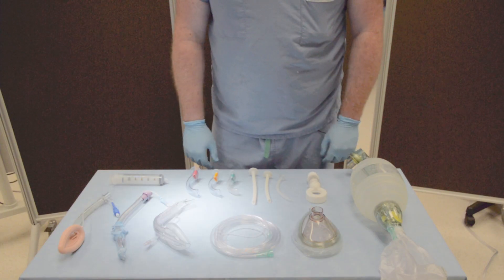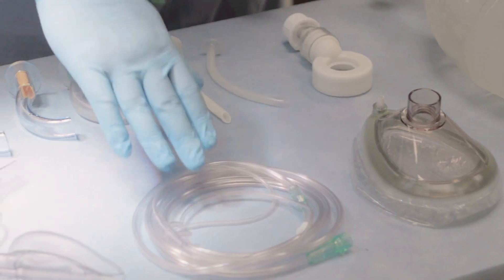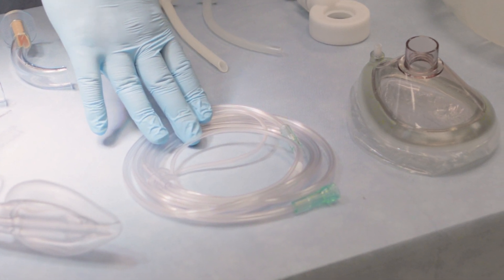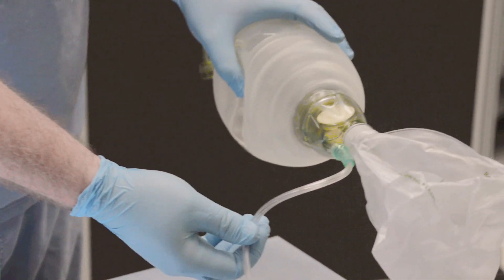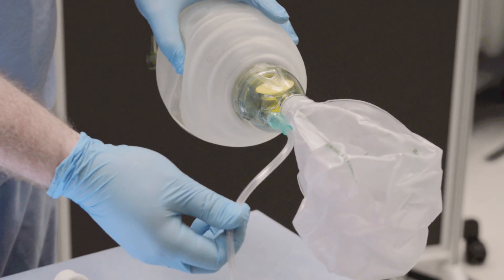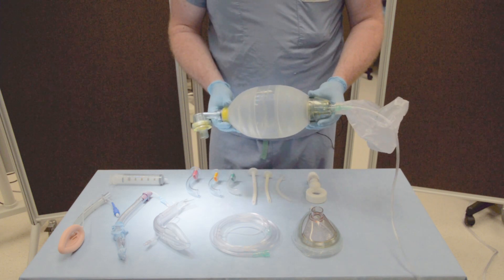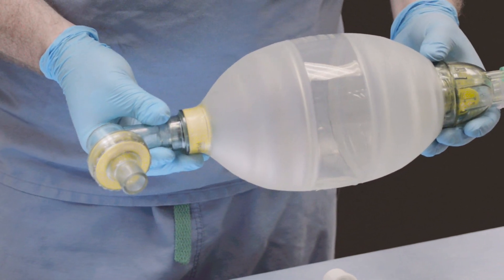Standard equipment for non-invasive oxygenation and ventilation with a bag mask ventilator device begins with high-flow nasal prongs attached to at least 15 liters of oxygen at a wall source or secondary tank. A second source of oxygen is attached to the back of the bag mask ventilator, also at 15 liters per minute. The bag mask ventilator device should be checked and confirmed that all pieces are attached and tightly put together beforehand.